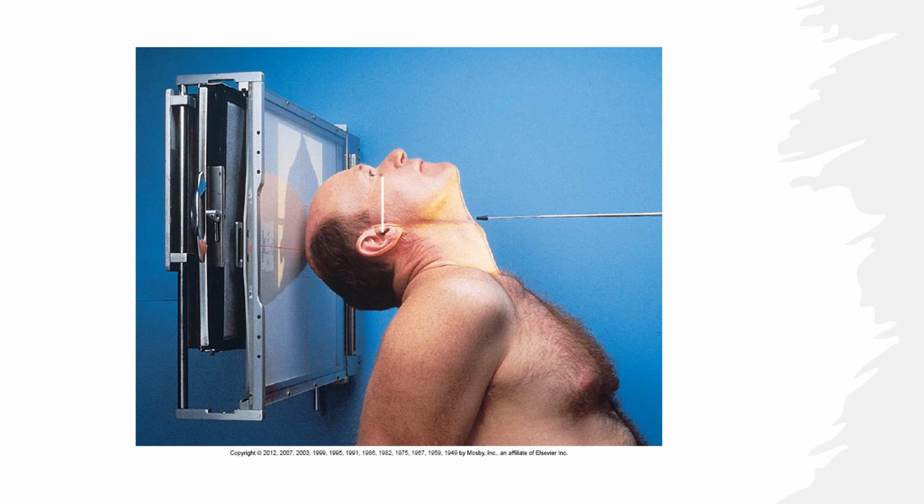In other words, if your patient can't tip their head back this far, get what you can, tell them to hold, and then apply a cephalad angle until the central ray is perpendicular to the IOML. And then just move the image receptor to catch the axial SMV. It will be elongated, but it'll be good enough.